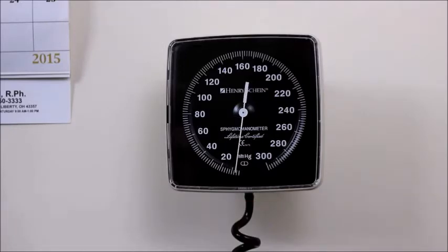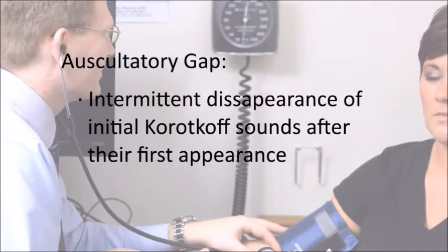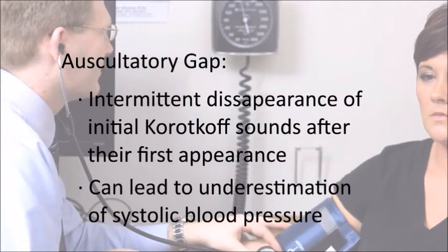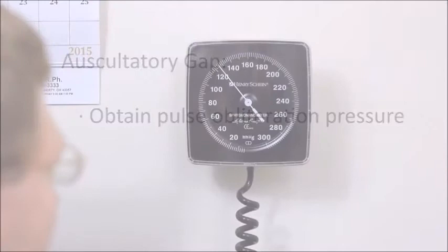An auscultatory gap is defined as the intermittent disappearance of the initial Korotkoff sounds after their first appearance. This phenomenon can lead to underestimation of systolic blood pressure. Obtaining the pulse obliteration pressure can be helpful in avoiding incorrect measurement.